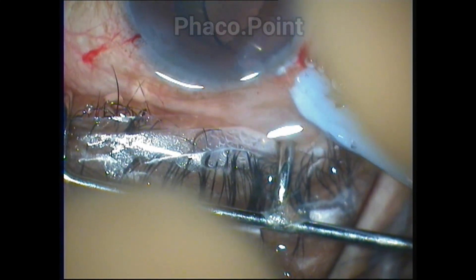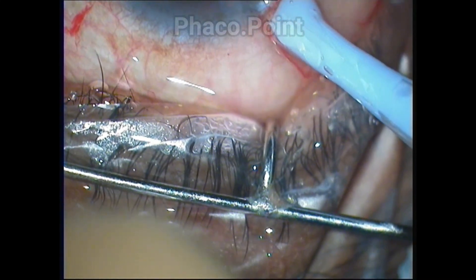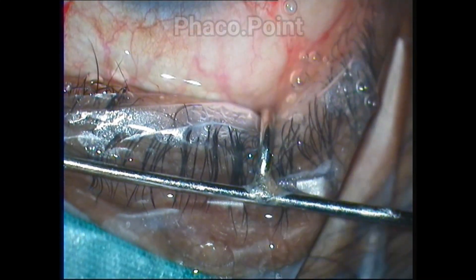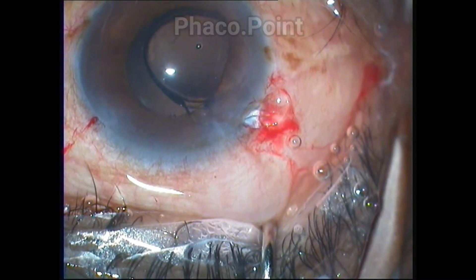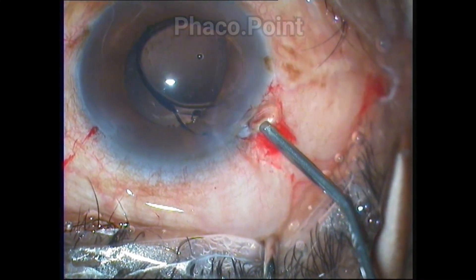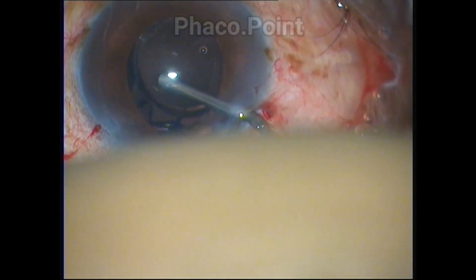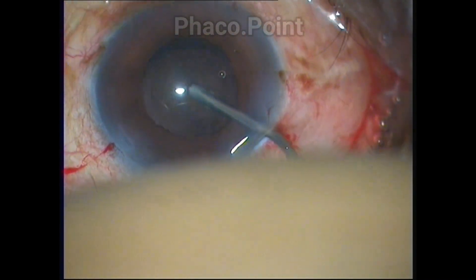As you can see, there is the stuck, unbroken haptic, which the surgeon holds and gradually pulls out from the stuck cartridge. Clearly there is a shallowing of the anterior chamber. The surgeon injects viscoelastic, and in this particular case, with the help of the viscoelastic itself, successfully injects the IOL.